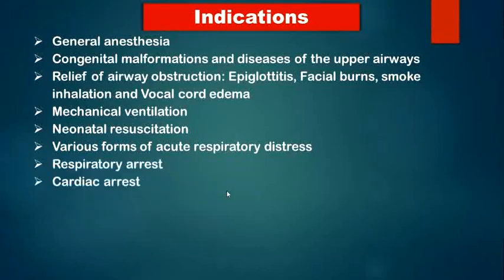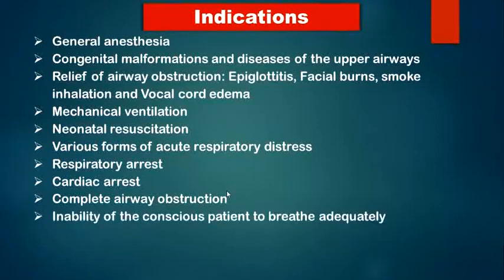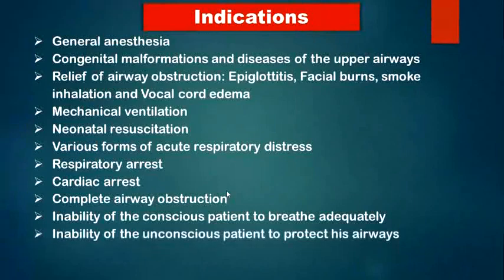Of course, in cases of cardiac and respiratory arrest, and if there is complete airway obstruction, shortly we say that there is no role for the ambo bag in complete airway obstruction. The role is for the intubation. And of course, inability of the conscious patient to breathe adequately. The patient is conscious, but there are problems with maintaining the breathing adequately, or inability of an unconscious patient to protect his airways.